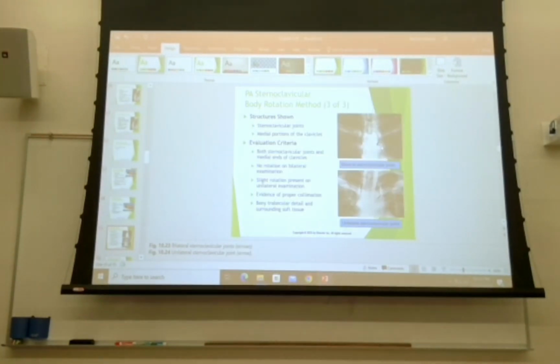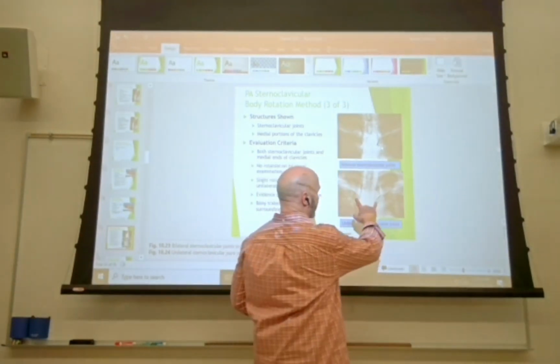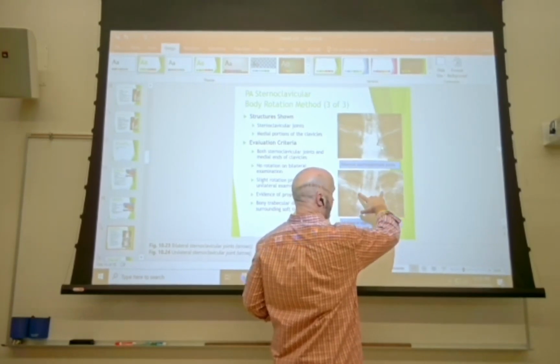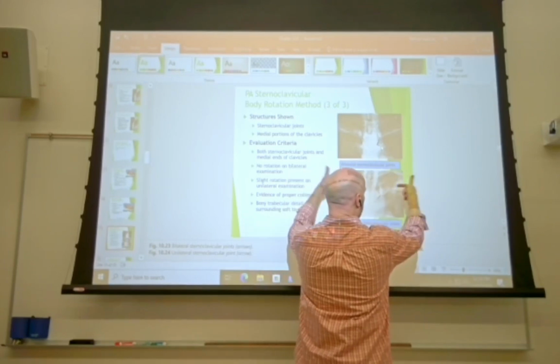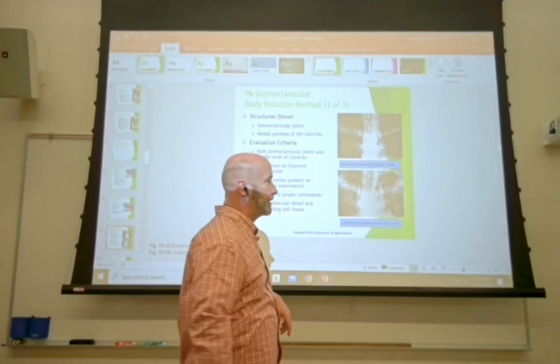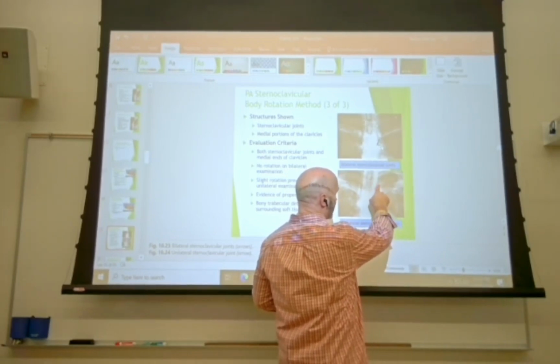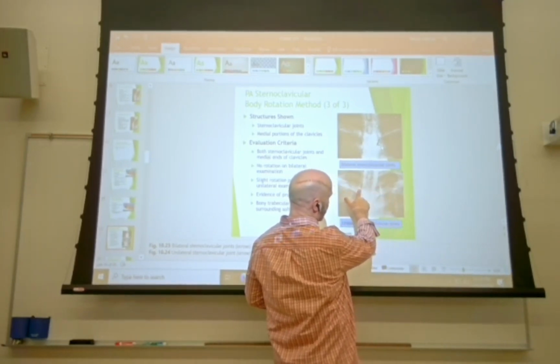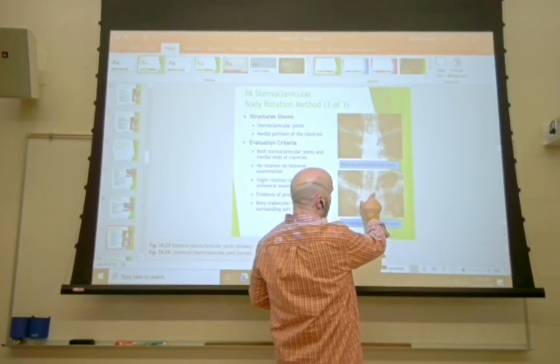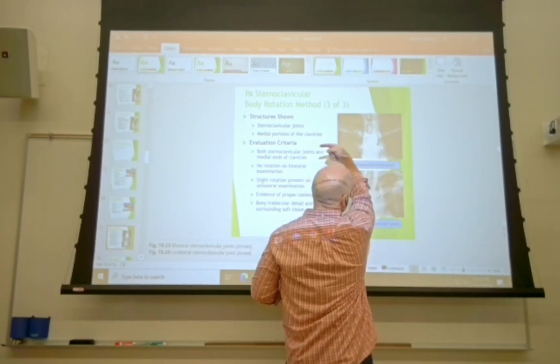And what we should see is this. If you remember back to your chest positioning, how we identify rotation from a PA projection is looking at where it looks like the clavicles intersect the spine. Of course, it doesn't, because the spine's back here and the clavicles are up here, but it looks like that on a two-dimensional image. So you should be able to see the difference in the gap between the spine and the clavicle on both of these. The patient was looking that direction for this one, and the patient was looking this direction for that one.